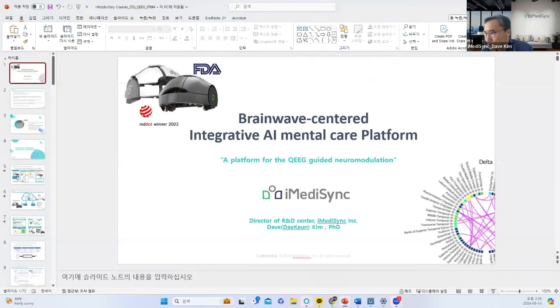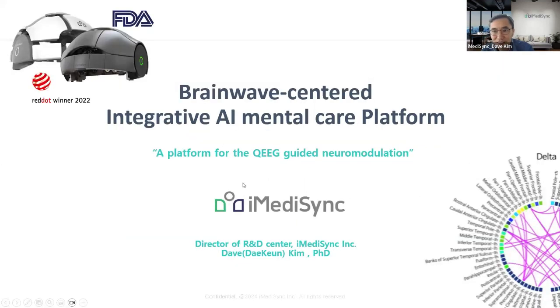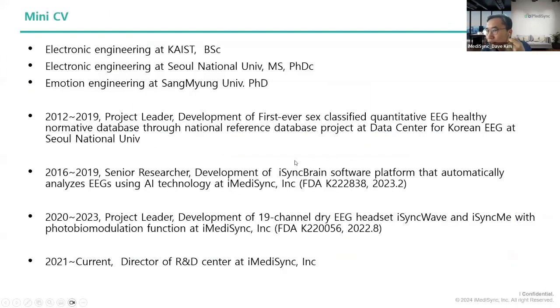And yes, this is today's title and the platform for the QEEG guided neuromodulation.